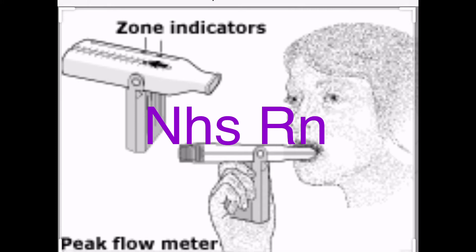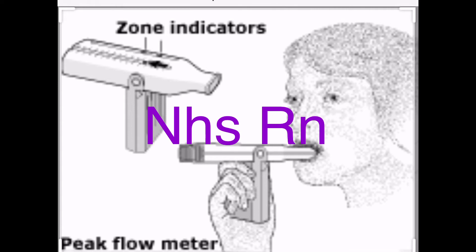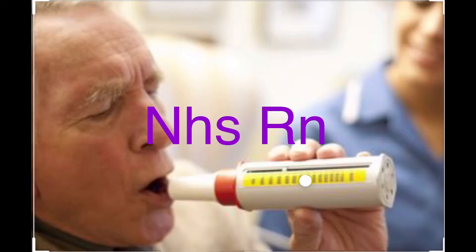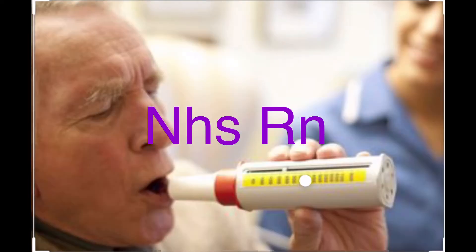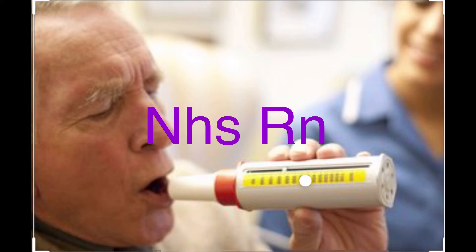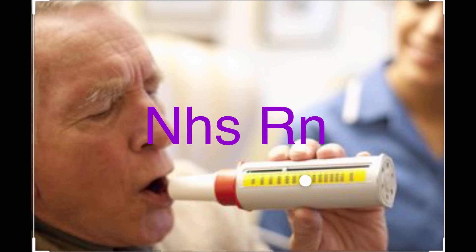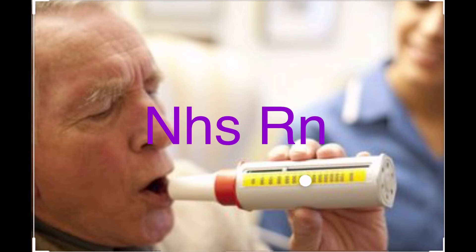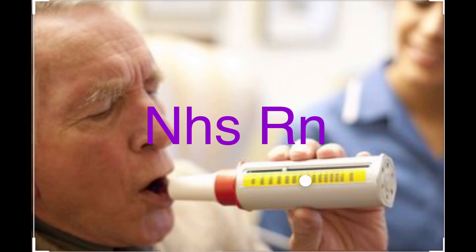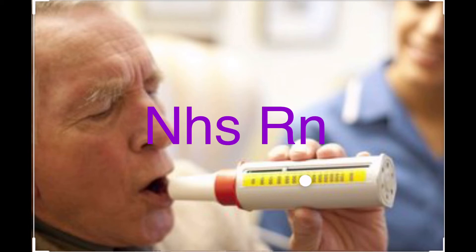After that, assemble your equipment. Always, always push the gauge to zero before you give the peak flow meter to the patient. This is the meter — always check that the gauge is at zero first.